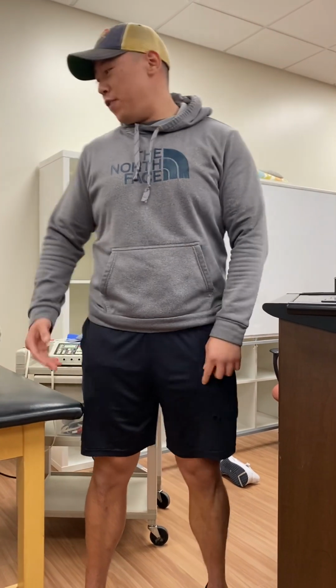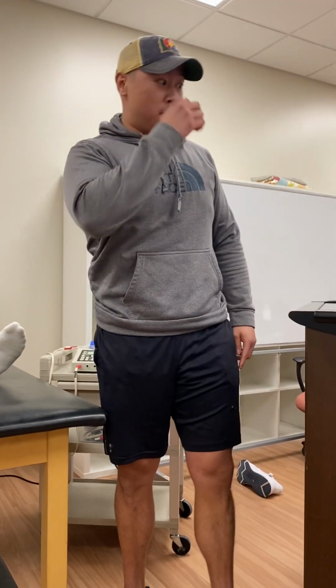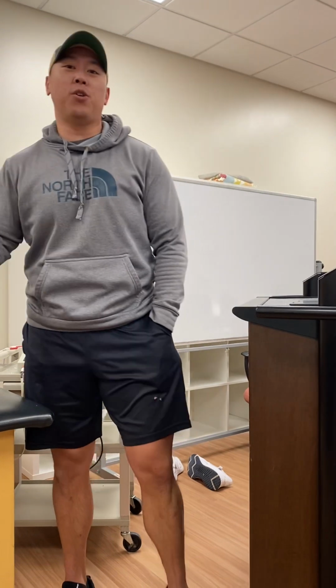I'm a student physical therapist here at Rocky Mount University. Today we're going to be doing a video on how to give estim onto a patient. So some indications of estim are going to be increased range of motion, reduction of muscle spasms, pain, and muscular re-education.